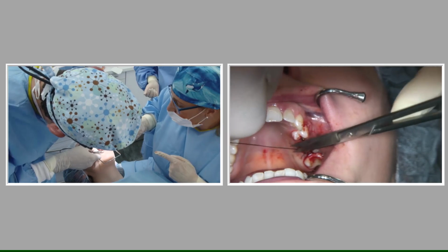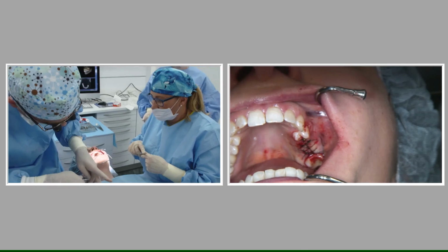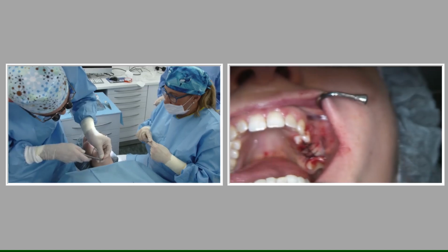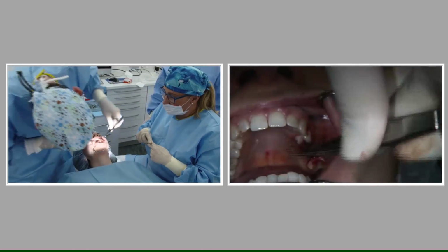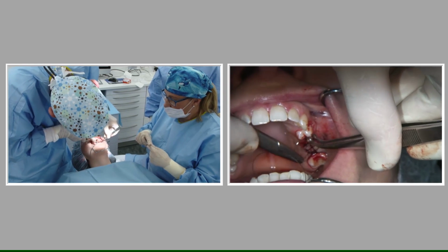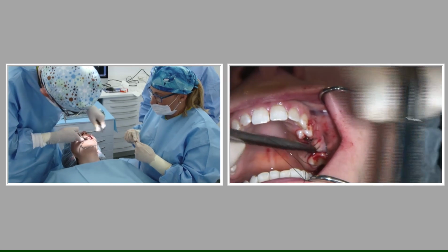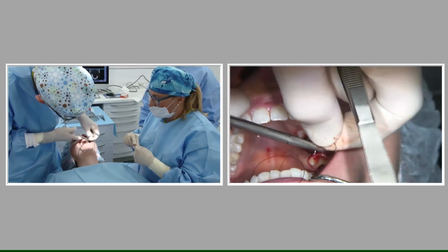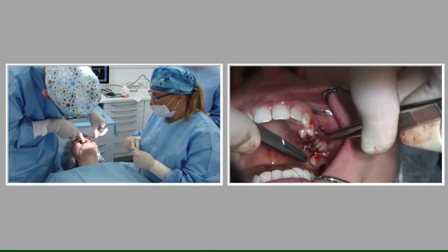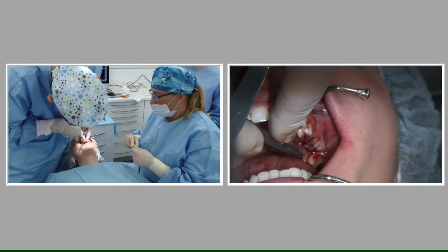So no relieving incision also means that we have a reduced operation time. We can suture it faster, only on the crestal area. So this was a minimally invasive implantation.